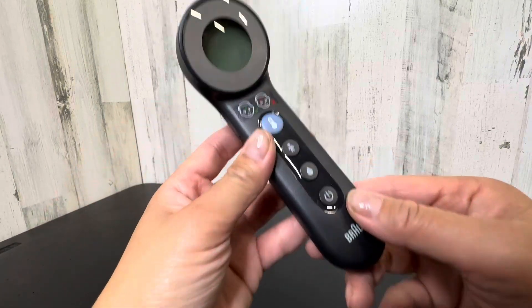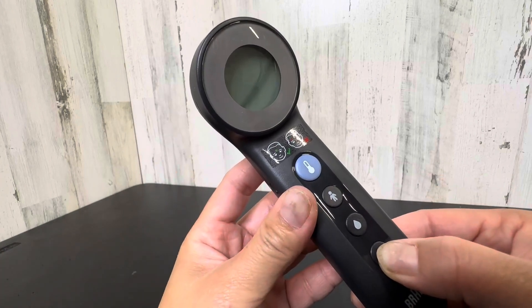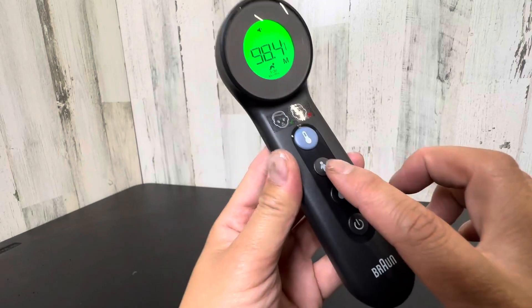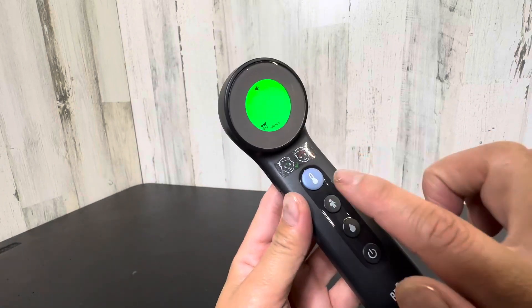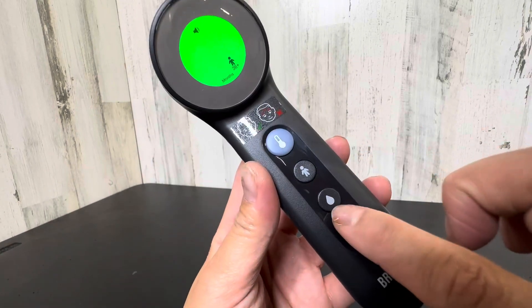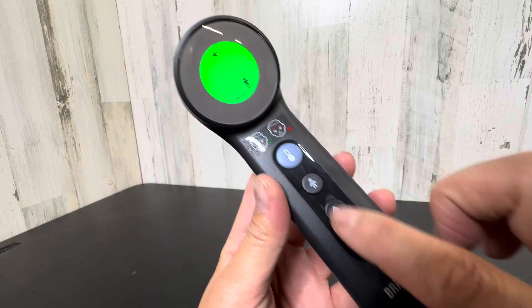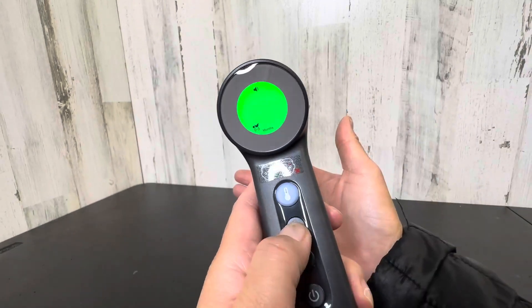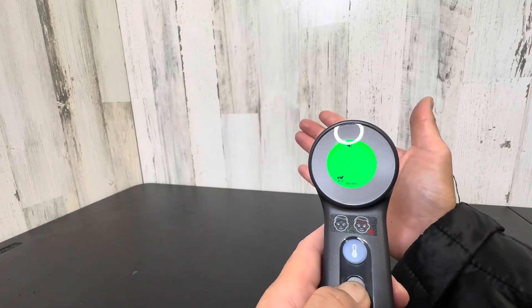So how you would use this is you obviously will turn this on. Then you have infants to adults — you can also test the water temperature with this. You hold this person button and you will get the temperature.